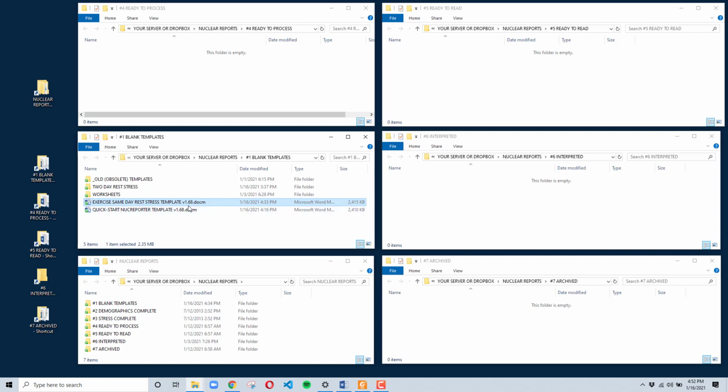And I started developing these templates for our nuclear reports in Word, and eventually decided to commercialize it. I tried a couple of other platforms, web platforms, but to get really nice looking reports, I had to export everything back into Word eventually anyway.